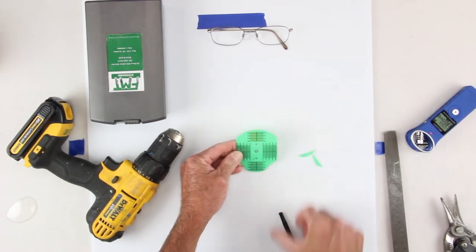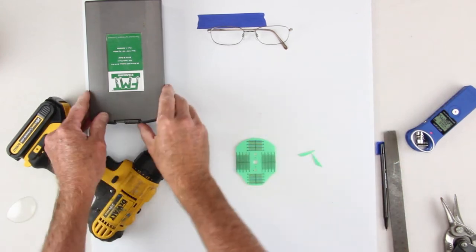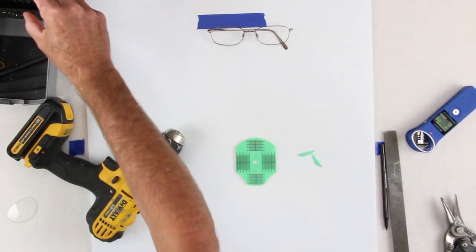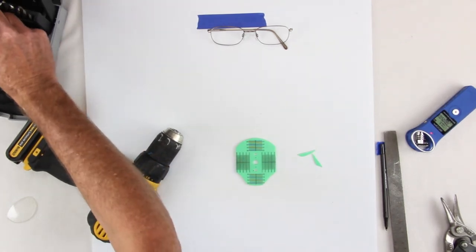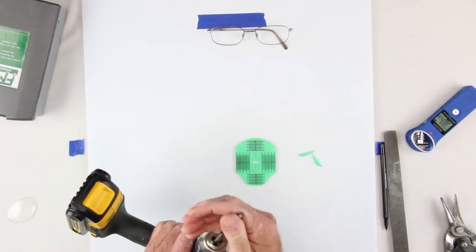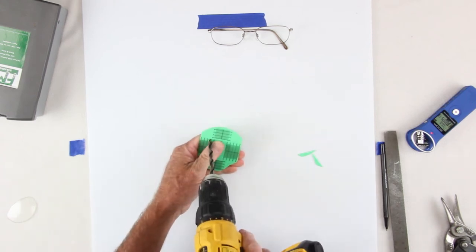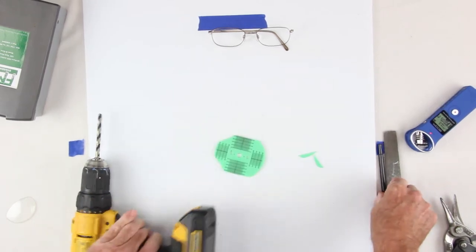All right, and eventually I'm going to want some eye holes. So let's set up for that. I'm going to just grab my drill index here, make it a decent size hole. Let's go a quarter inch here. And again, I can go right in between my 25 and my 25. Why don't we go ahead and mark that?